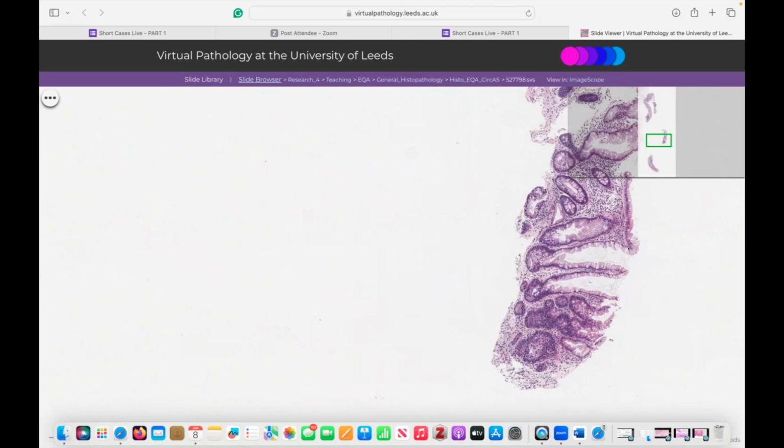So it's a morphologic diagnosis. Yes, it's morphology. What IHCs do you want for this? So what is the diagnosis for this case then? Sessile serrated lesion with dysplasia, with low-grade dysplasia. This is your complete answer.